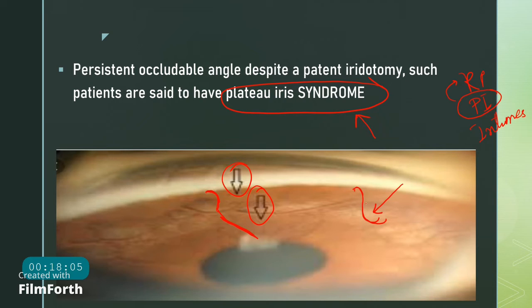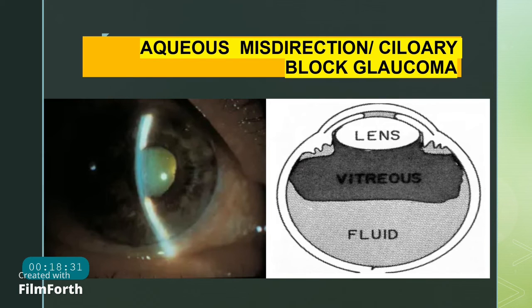When you put indentation, the central part gets deepened when the periphery is still shallow because of the anteriorly positioned ciliary body processes. Similarly, you can see here, okay, so this is quite a narrow entry. You can see the corneal wedge, but you cannot see them joining together, okay, and then you can see this roll like this, and then again you can see a roll like this. This is called double hump sign, also called the sine wave pattern seen in indentation gonioscopy.